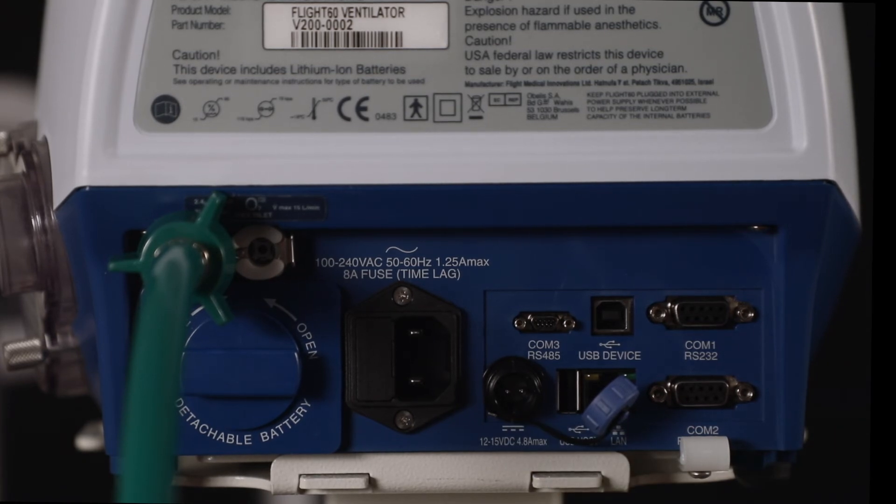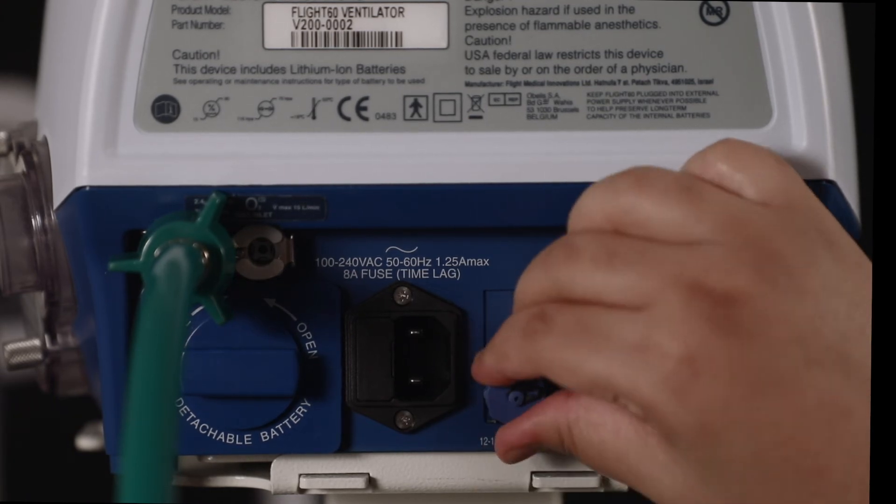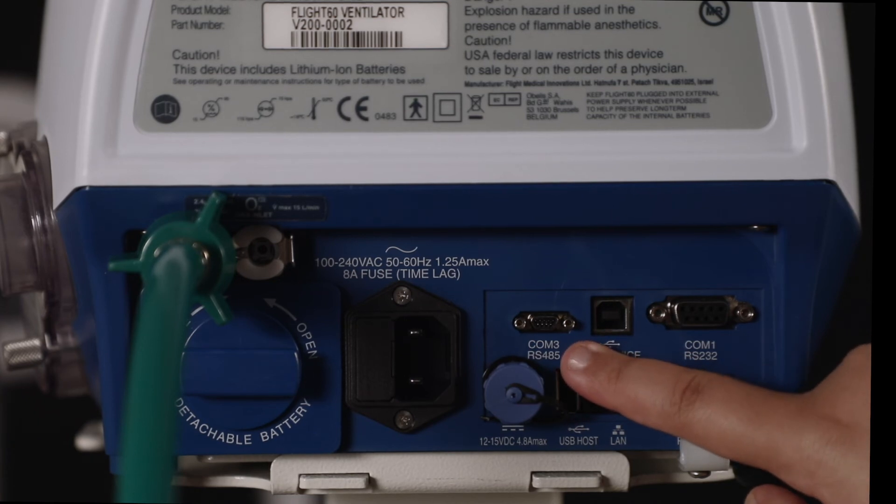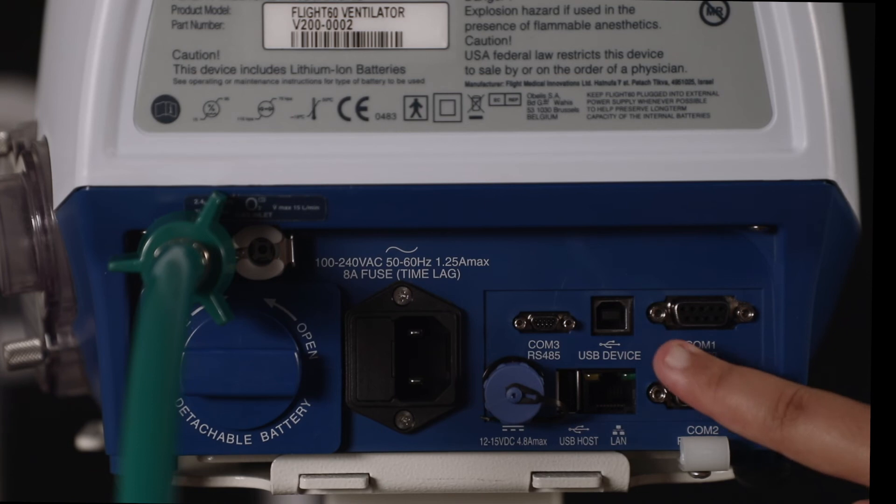To close it, simply put the cap back on and rotate it clockwise. On the right, we have a communication port and a USB device port which can be connected here.